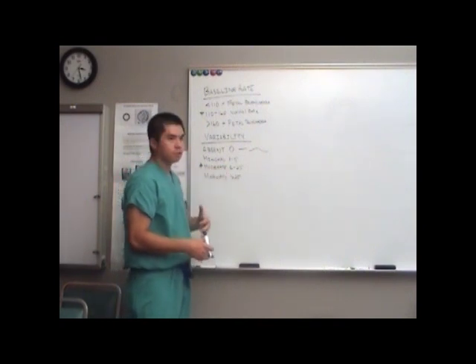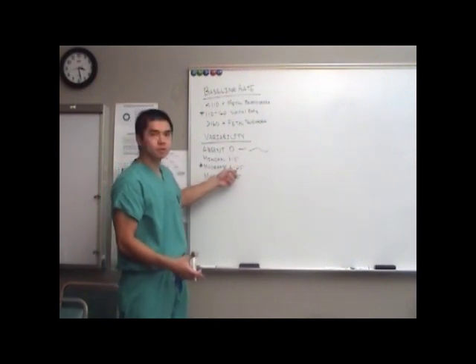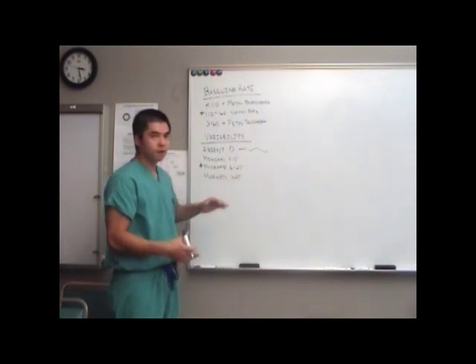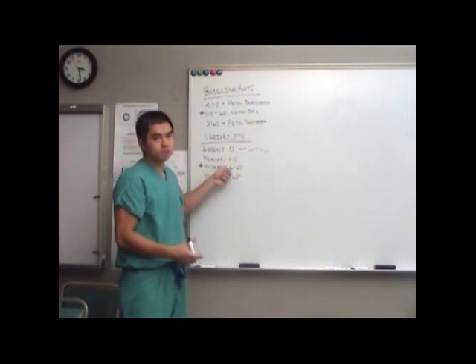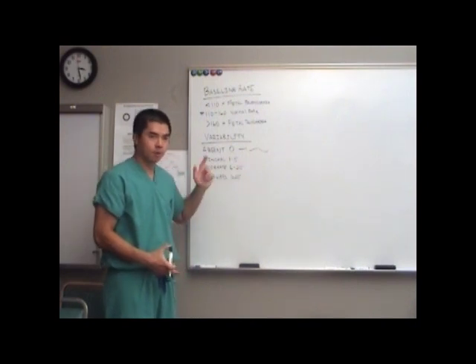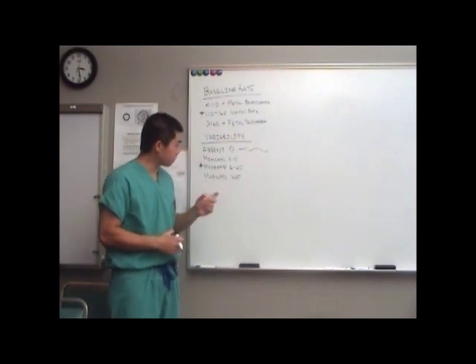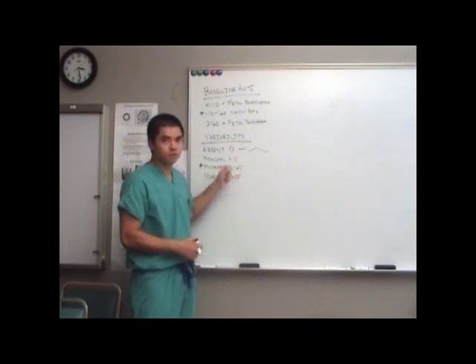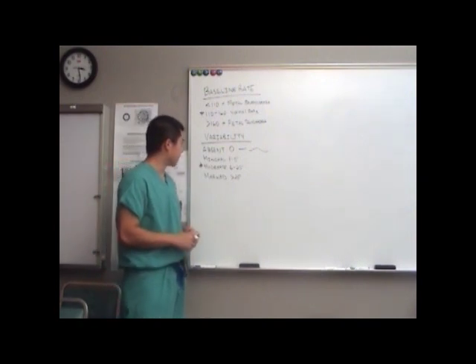Okay. So again, we talked about scale, and we're talking about variability here. So in order to get moderate variability, how much of a box variation do you have to have? What does 6 correspond to? Just slightly over half a box. So you don't have to get much variation on your screen in order to get moderate variability. It's only half a box. So it ranges from half a box to 2.5 boxes. So remember that, because sometimes we see a fetal heart tracing, and it looks like there's not much variability, but the definition of moderate variability is only a variation of 6 to 25 beats. So keep that in mind.